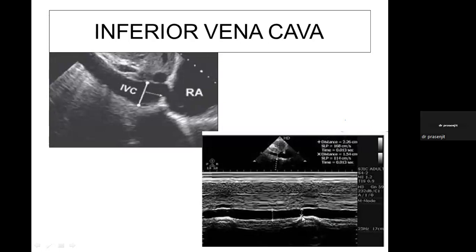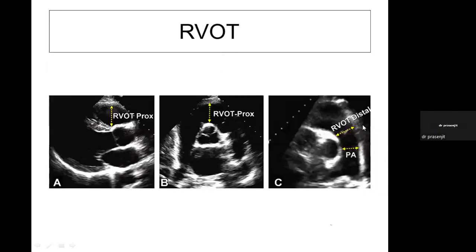Now, the difference between these two, the largest and the smallest, is the amount this IVC has collapsed. When expressed as a function of the largest diameter, this becomes the collapsibility index. Thank you.